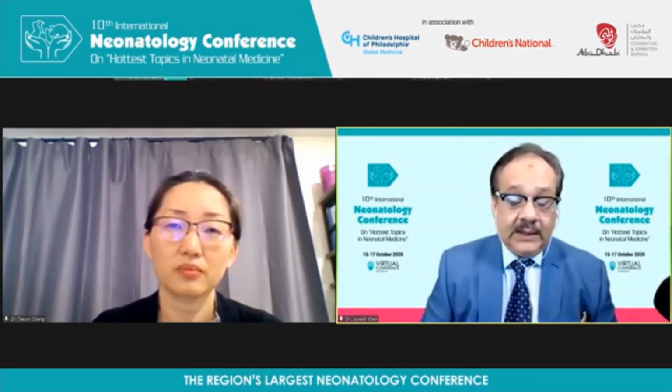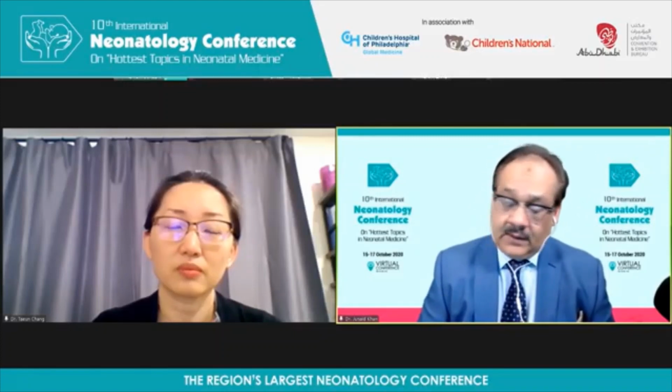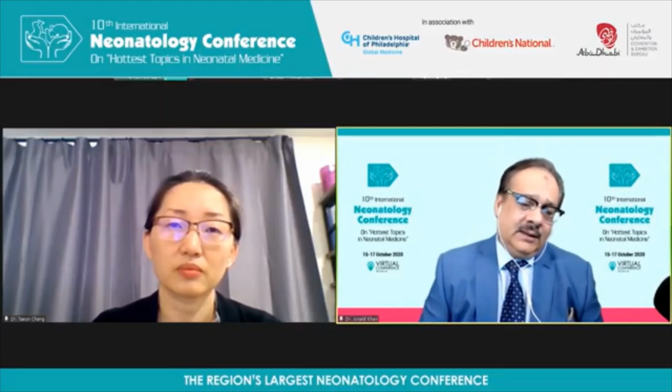Okay, another question is also interesting: is there any difference in neurological assessment when you are doing the EEG of term and near-term neonates versus the preterm neonates? Obviously. Yeah, the EEG changes a lot. If you look at a 24-week EEG, they have a burst of brain activity and then it can be flat for 10 or 20 seconds. If you saw that kind of EEG pattern on you or me, we would say, oh my, you must be in a coma. That's burst suppression. That is not burst suppression in a newborn.